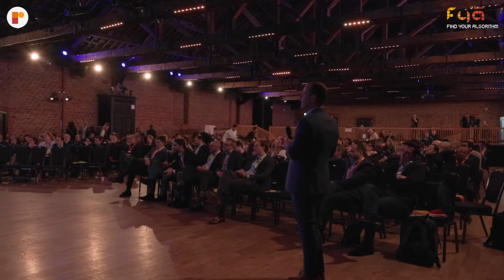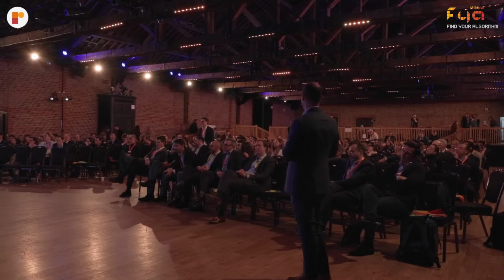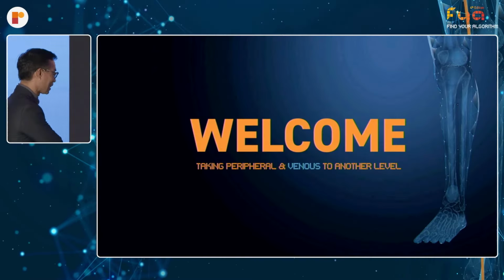So, Edward, now I'm sorry, but probably I'm not the most intelligent in the room, but I'm completely confused now, because in the first presentation we had Daniel. Please take the microphone, Daniel. We had Daniel, who invested a lot in wire technology, and he said you have to change wires and try to learn the chart. And you are showing us that you try with your wire, it doesn't work, you go retrograde, everything is fine. And all this technology and theory behind wires for a retrograde approach actually doesn't play any role, because you're using only one workhorse wire, a V18, and you're taking your CXI and you're going through everything. So now, I am, let's say, a guy that wants to start doing CTO lesions. What should I do? Should I focus on wires? Should I focus on the retrograde approach? Should I focus on taking better support catheters? So I want a comment from your side and a comment from Daniel to close these two nice talks.